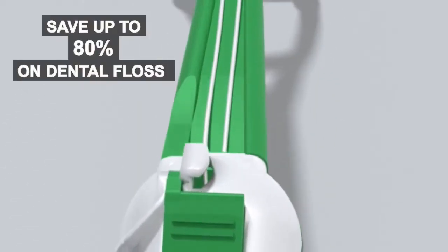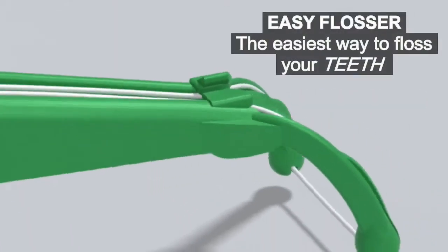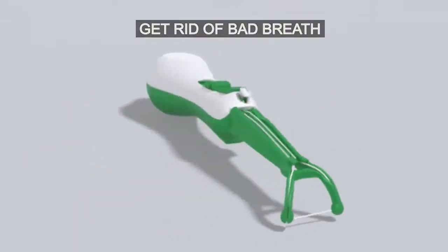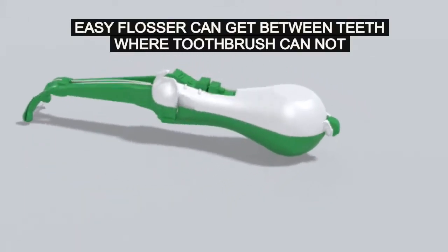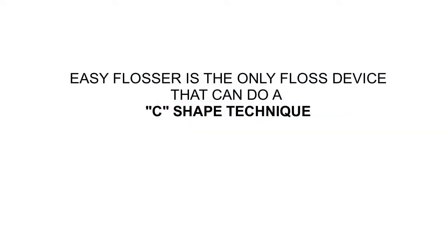Save up to 80% on dental floss, prevent cavities and gum disease. Easy Flosser — the easiest way to floss your teeth. Get rid of bad breath. Easy Flosser can get between teeth where toothbrushes cannot. Easy Flosser is the only floss device that can do a C-shaped technique that's recommended by dentists.